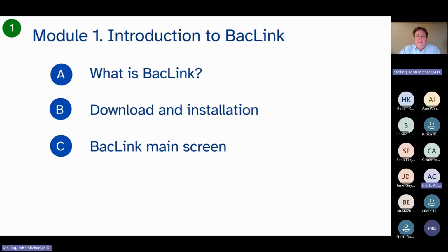So module 1 has 3 sections, A, B, and C. What is BacLink? And that's what I will do now with the PowerPoint. And then how do you download and install WHONET? We'll do that, WHONET and BacLink. We'll talk about that very quickly. And the BacLink main screen. So using PowerPoint, I will do A, and then with a live demo, I will do B and C.